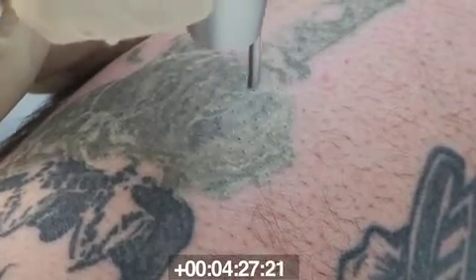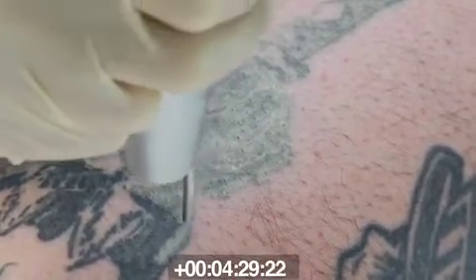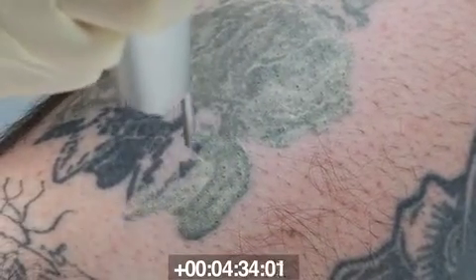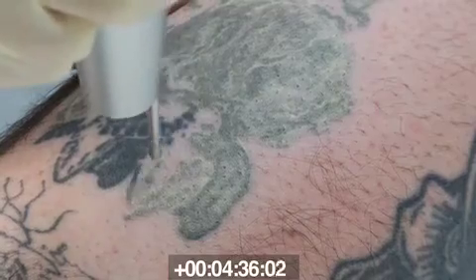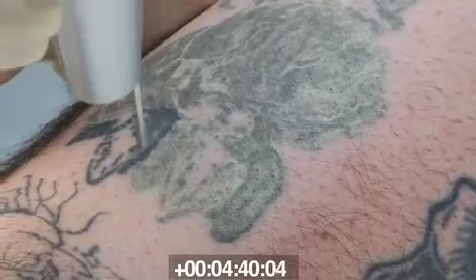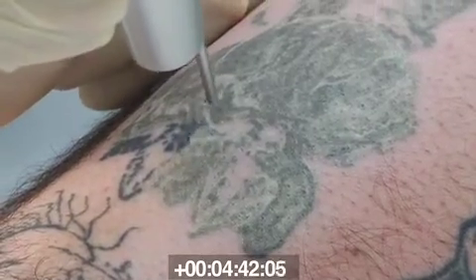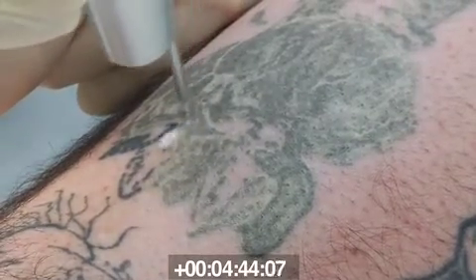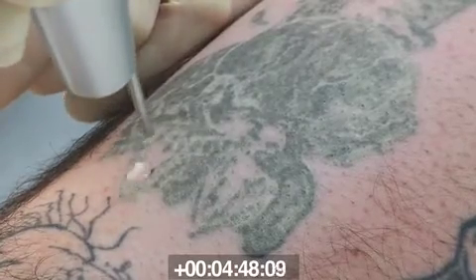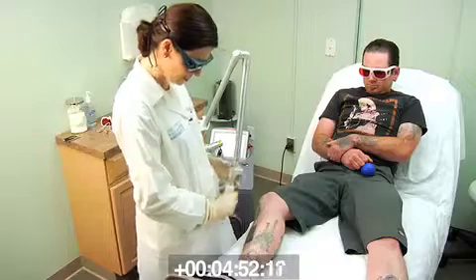This helps with discomfort, and it also helps reduce risks of complications such as blistering. Blistering almost never occurs with the 1064, but it can occur with the 532 nanometer wavelengths, as it's a shorter wavelength and can cause more epidermal injury. But 1064 is a nice deep dermal wavelength, rarely causes blistering, and you can see that's a beautiful first treatment for a black tattoo.